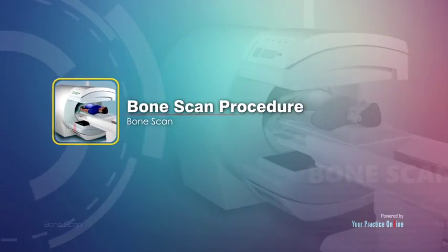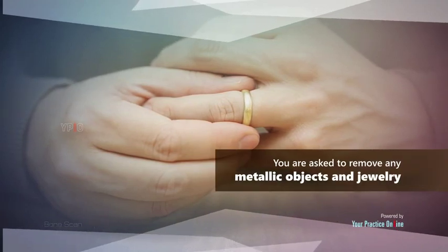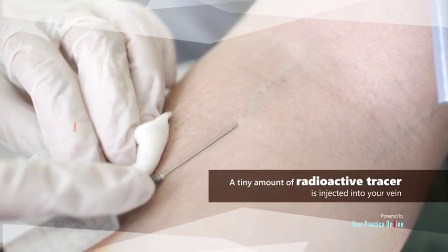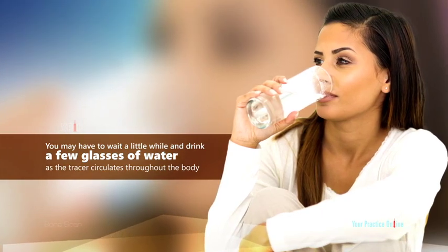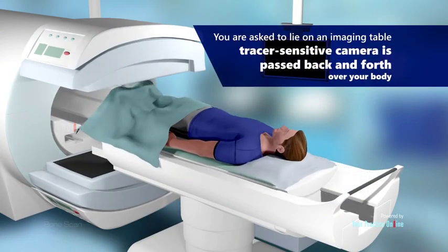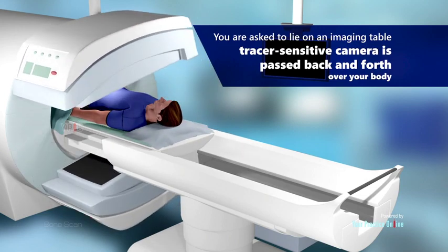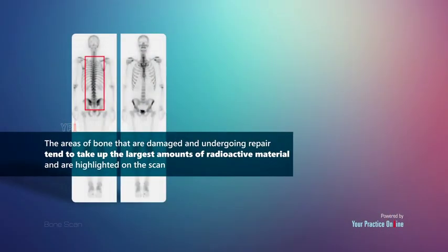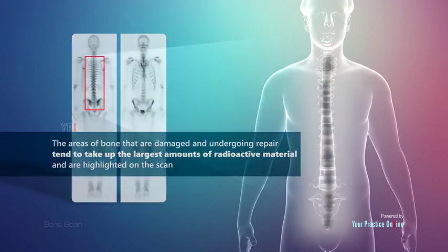Bone scan procedure. The bone scan procedure involves the following steps. You are asked to remove any metallic objects and jewelry. A tiny amount of radioactive tracer is injected into your vein. You may have to wait a little while and drink a few glasses of water as the tracer circulates throughout the body. After enough time has elapsed, you are asked to lie on an imaging table and a tracer-sensitive camera is passed back and forth over your body. The areas of bone that are damaged and undergoing repair tend to take up the largest amounts of radioactive material and are highlighted on the scan.